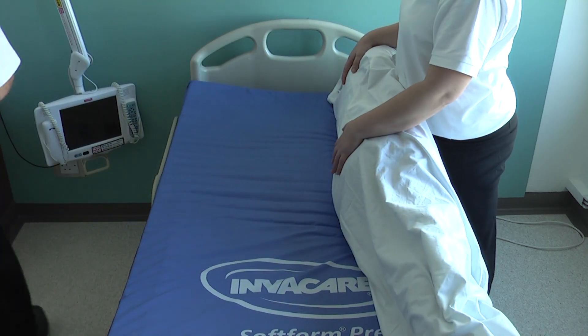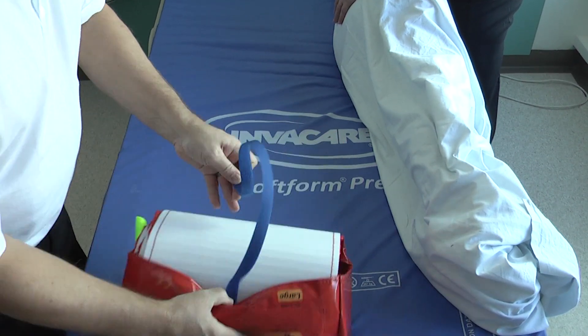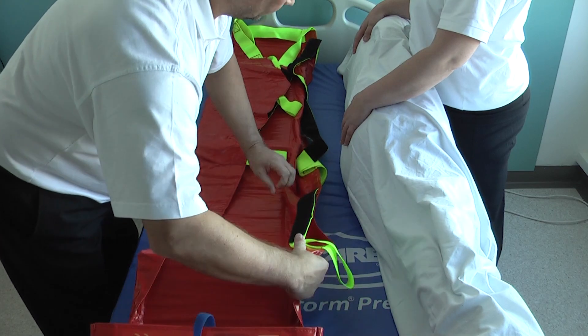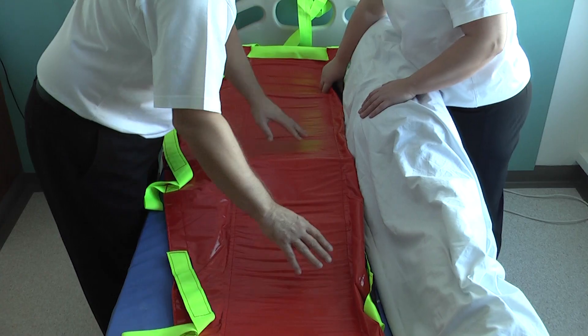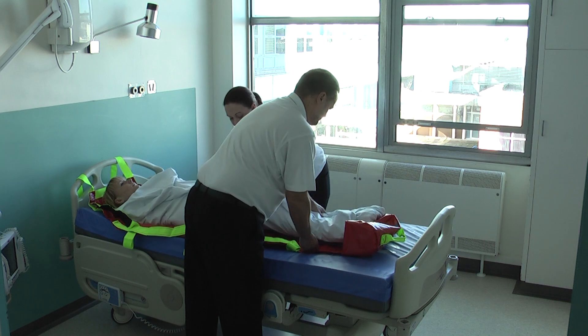The ALBAC mat can easily be unrolled after releasing the blue fastening strap by holding the yellow handle and simply throwing it out or by rolling it out on the bed. Carefully place the ALBAC mat alongside them ensuring it's tight against their back and legs. Gently roll them back onto the ALBAC mat ensuring they are positioned centrally before placing their feet into the pocket.